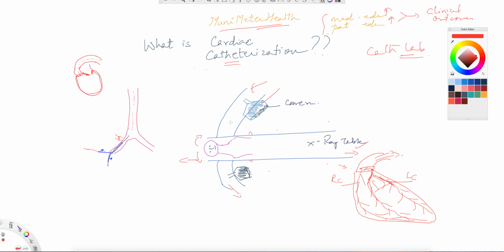They'll be checking your blood pressure. They've already drawn some bloods here. All of that is being taken into account, and EKG monitoring will be done on the chest here, and all these wires will be going on to an EKG for testing, and of course you'll have a blood pressure cuff attached here as well. So all of these monitoring things are going on while the dye is being injected. Now, the dye, D-Y-E, as that is being injected, is a contrast, basically helping visualize these coronary vessels.